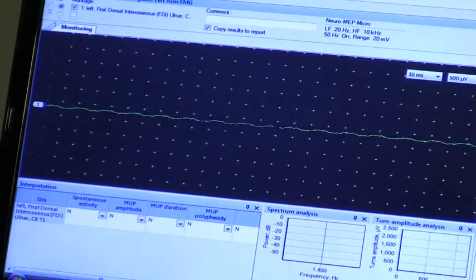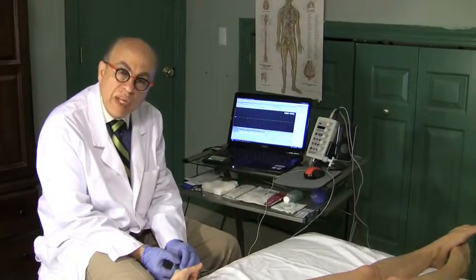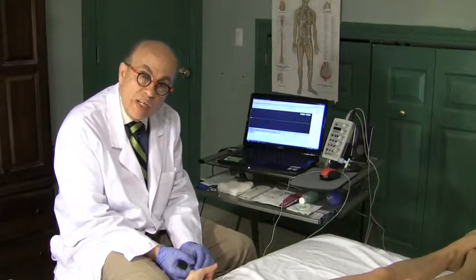Either you have hit the area where the nerve enters the muscle, and that's spontaneous activity, which is called end plate potentials. And these are perfectly normal, but they will hurt the patient. It will be painful. The patient will let you know.